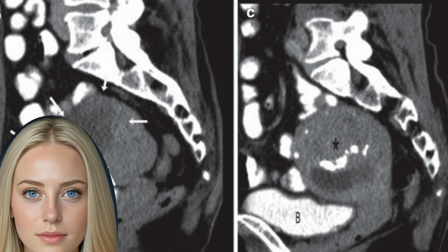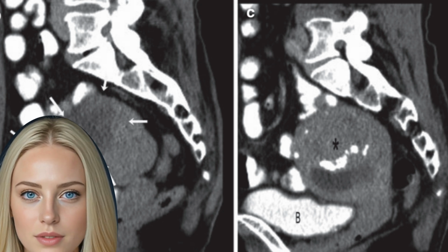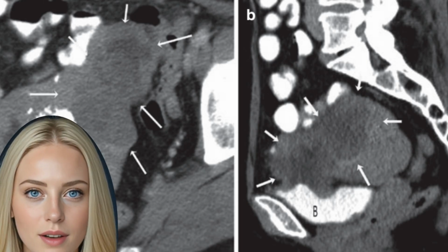The PET/CT offers promising possibilities for staging, grading and therapy control for sarcomas. All in all, differentiating between leiomyoma and leiomyosarcoma is challenging by using MRI. Apart from a fast growth, a large heterogeneous tumor, hypervascular foci or central necrotic components can be indicators.